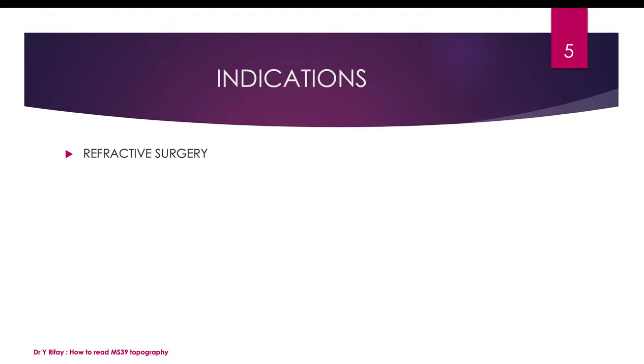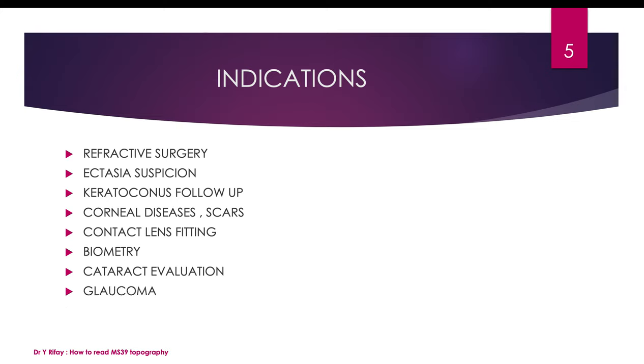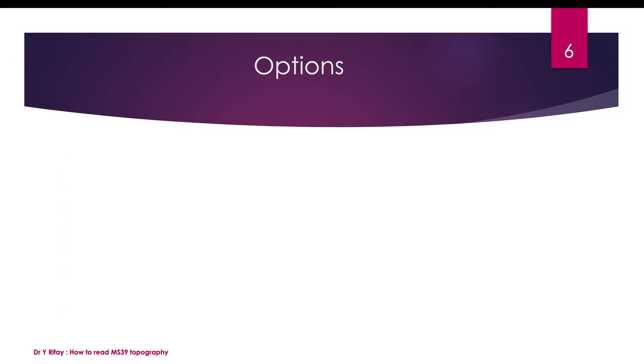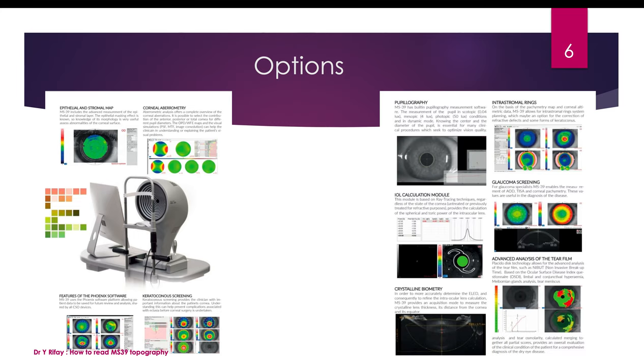Indications are refractive surgery, ectasia suspicion, keratoconus follow-up, corneal diseases and scars, contact lens fitting, biometry, cataract evaluation, glaucoma, dry eye, and others. What are the options? There are a lot of options in this device that we will see in this presentation.